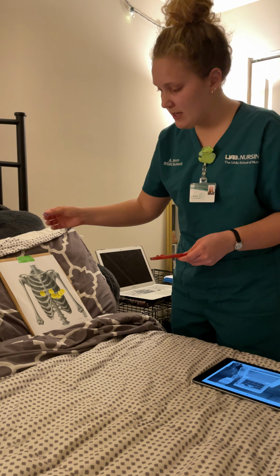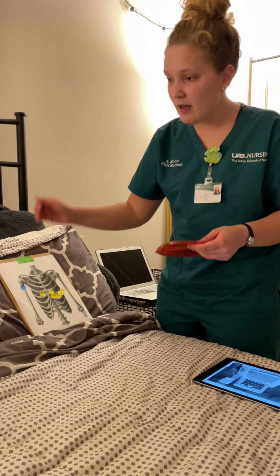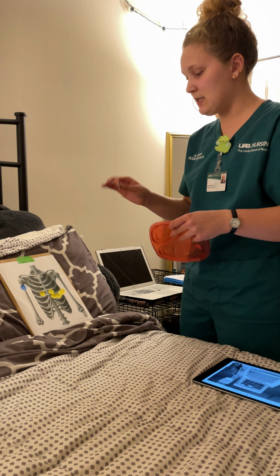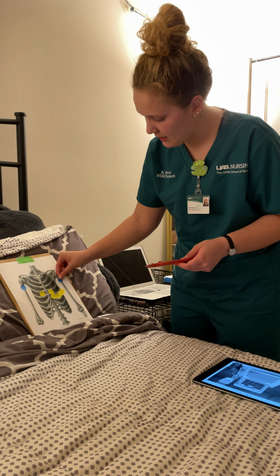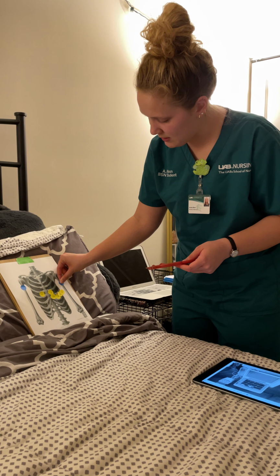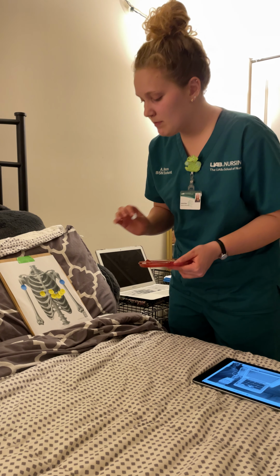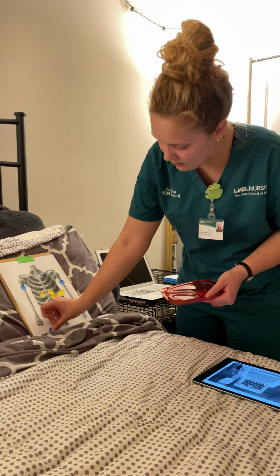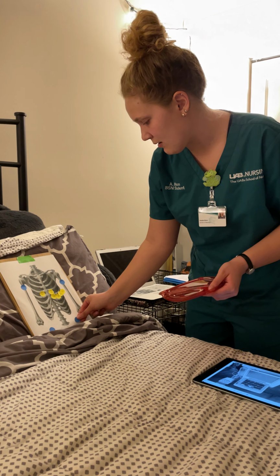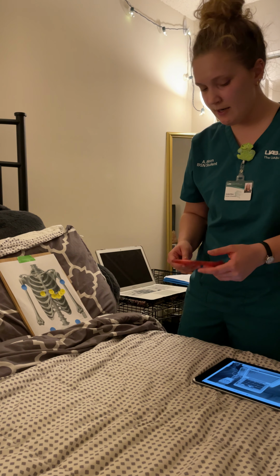First, my upper extremity, so the right upper limb lead. Again, having the sticker point down towards the heart, and then the same thing on the left side, making sure that they're symmetrical. And then the same on the lower limbs, the right side, and then symmetrically on the left side.